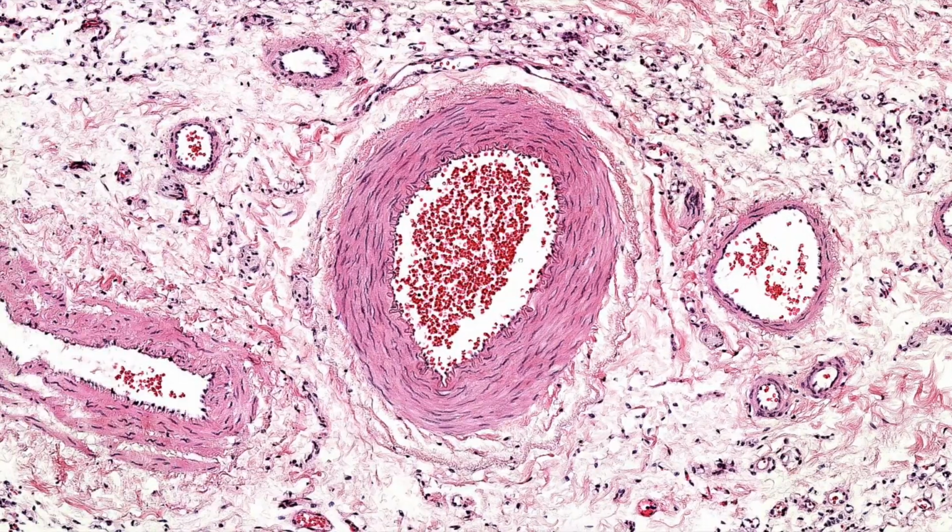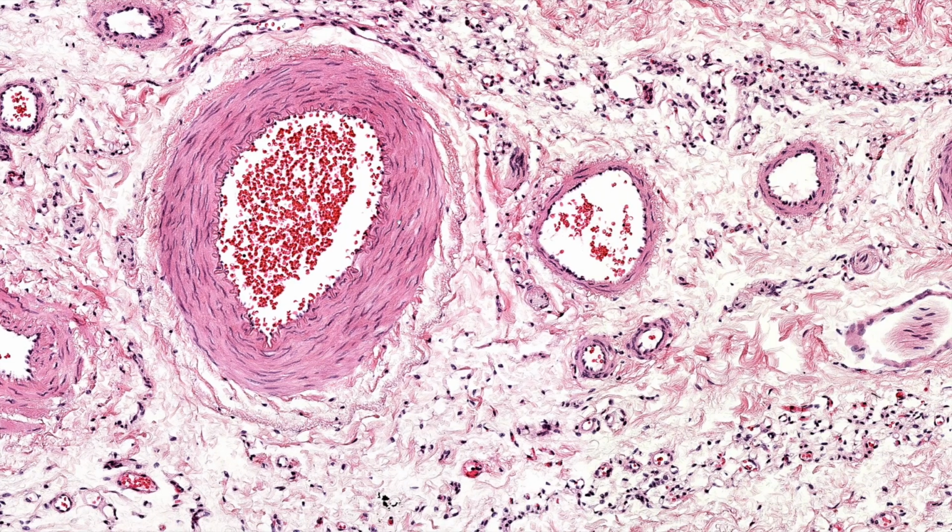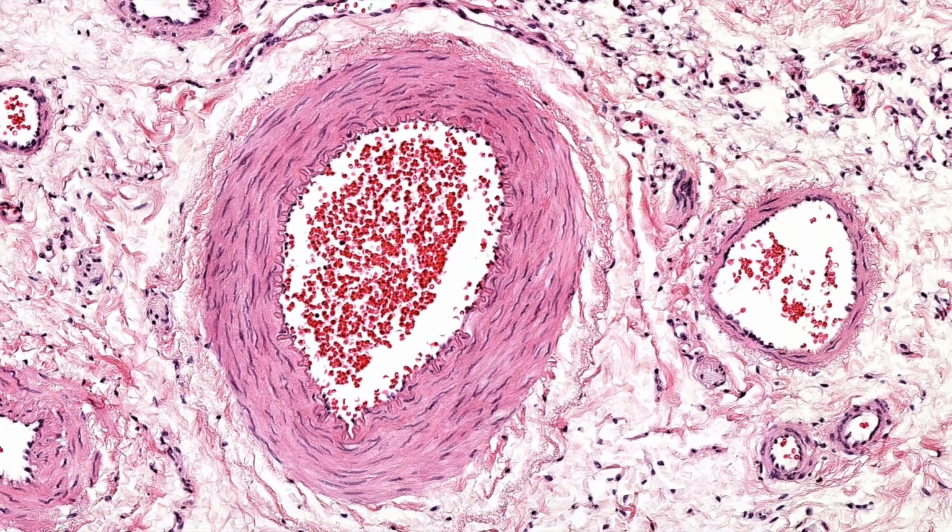Steroid injections. Yeah, definitely. If you inject steroid too deep, too much, too strong down into the subcutis, it can certainly shrink and atrophy the fat. That's true. Anything else? Look at this artery in the meantime with that nice internal elastic lamina.